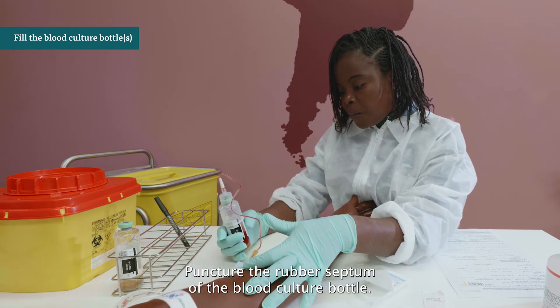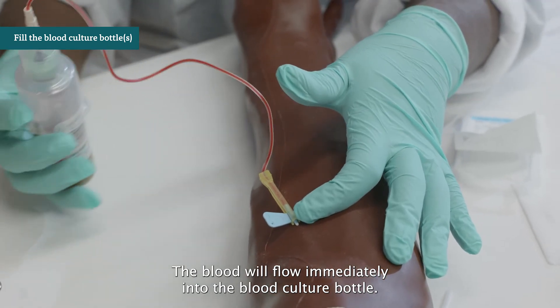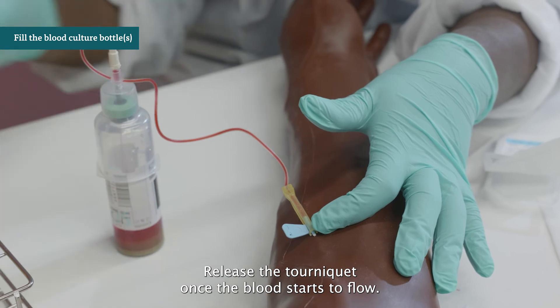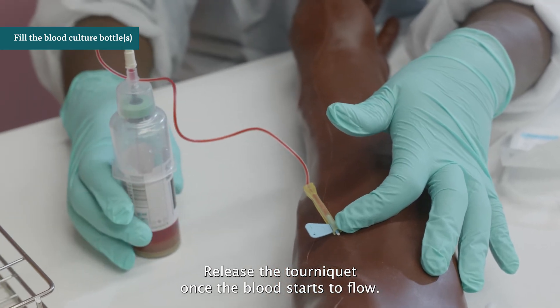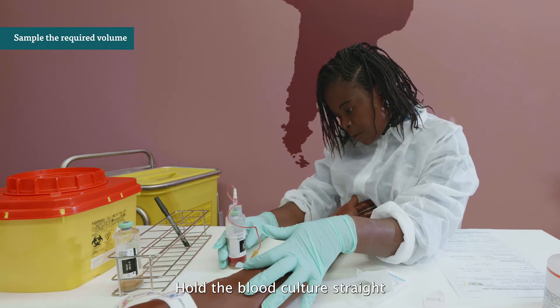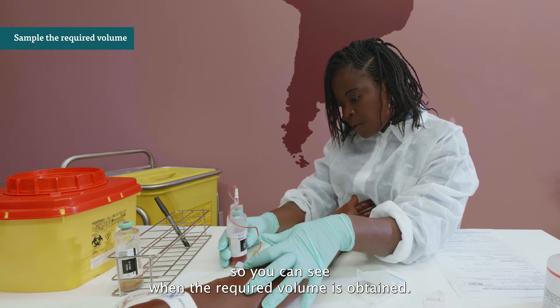Insert the blood culture bottle into the blood culture holder and puncture the rubber septum. The blood will flow immediately into the bottle. Release the tourniquet once the blood starts to flow. If the venipuncture fails, repeat the procedure from antisepsis onwards with a new sterile needle and a new venipuncture site. Hold the blood culture bottle straight so you can see when the required volume is obtained.